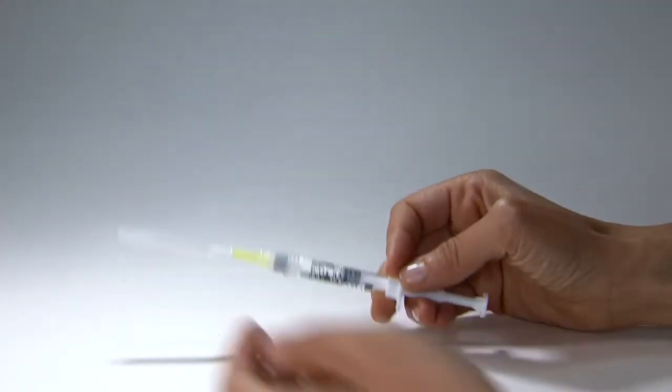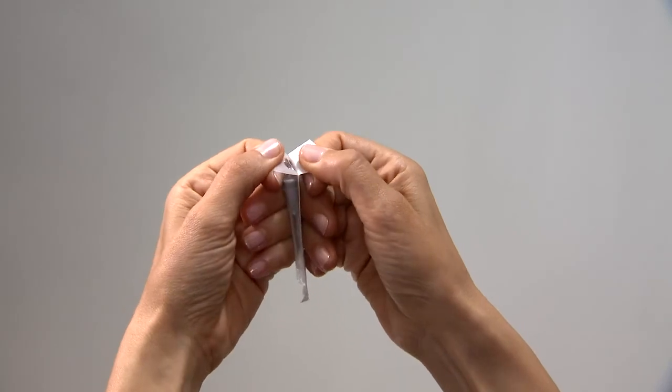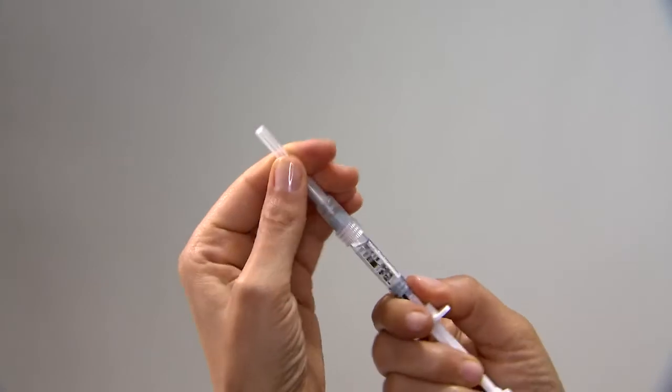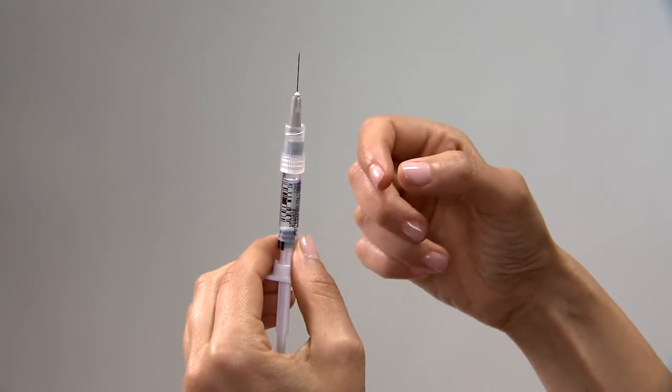Recap the syringe needle. Detach the mixing needle from the syringe and lay down the syringe. Remove the wrapping from the gray injection needle. Twist the injection needle onto the syringe and remove the cover of the needle. Remove any bubbles by pointing the needle up and tapping on the syringe. Push the plunger carefully until a small drop of liquid begins to appear from the tip of the needle.